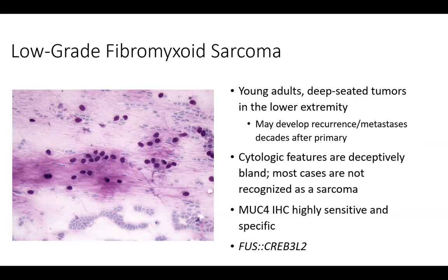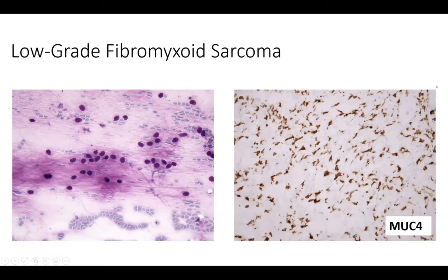MUC4 is highly sensitive and specific and is negative in all the benign mimics. If the laboratory has FUS FISH available, that can also support the diagnosis. But in some cases, it may not be possible, and you have to be descriptive, but also raise the possibility of malignancy, particularly if the patient fits this presentation. And here's a picture of MUC4 showing that characteristic cytoplasmic diagnostic staining.